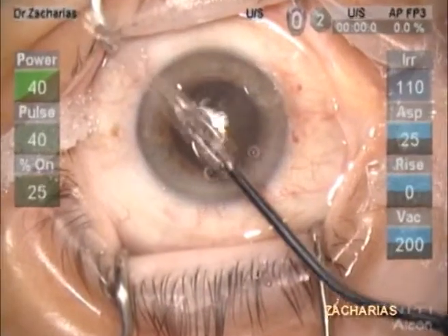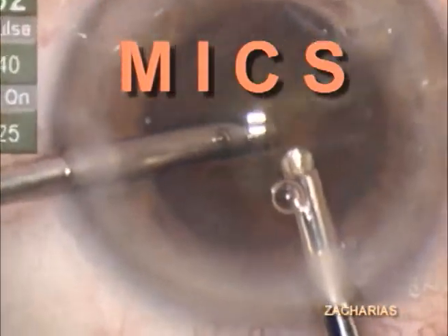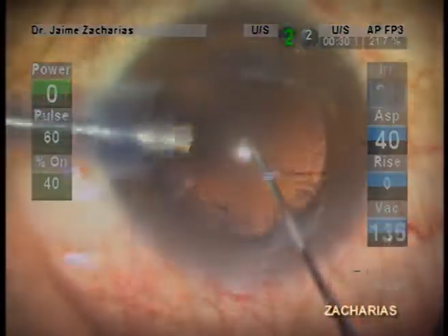This film is aimed to disclose our recent efforts to develop alternative techniques to improve anterior chamber stability during micro-incision cataract surgery, and also to improve the capsule safety factor of ultrasonic lens removal. Phacoemulsification has been perfected into the safe, fast, and predictable technique we know today.